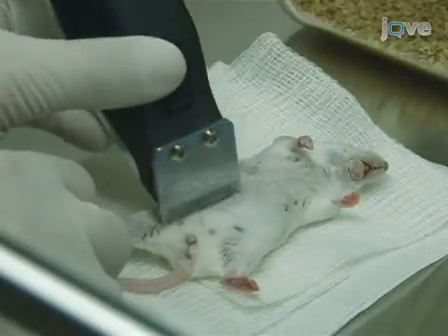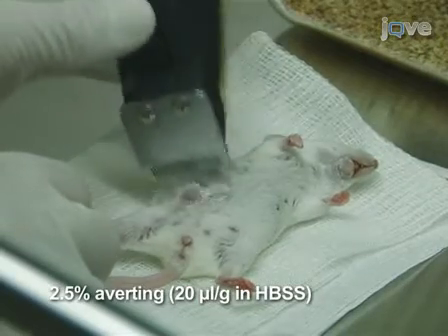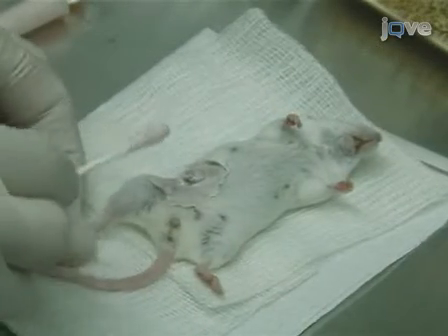After anaesthetising the mouse with 2.5% avertin, use a small animal shaver to shave the area above the tumour. Use Nair hair removal cream to remove the rest of the hair, and clean the skin using ethanol-dipped Q-tips.